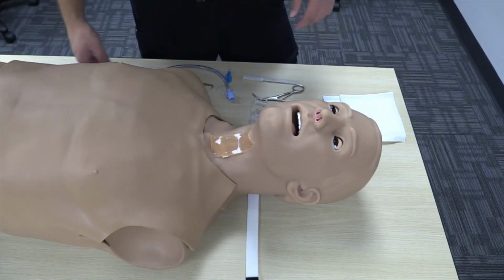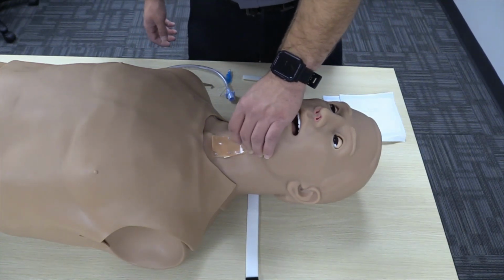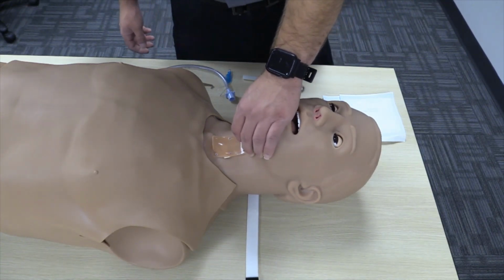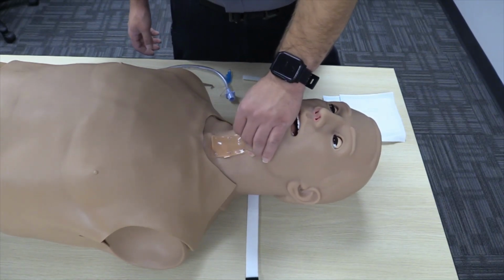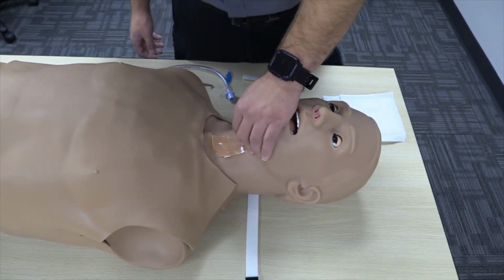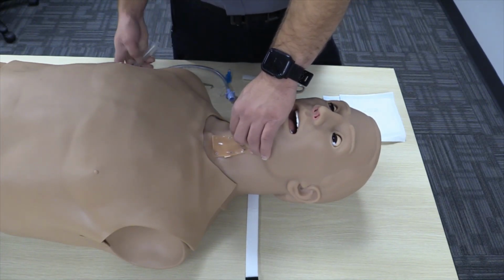Okay, now we're actually going to go through the procedure. So I'm going to find my landmark. There's a couple different methods that you can use to do this. What I'm going to be doing today is pinching my Adam's apple, or the thyroid cartilage, and feeling right underneath it. I can feel here that I have my cricothyroid membrane.